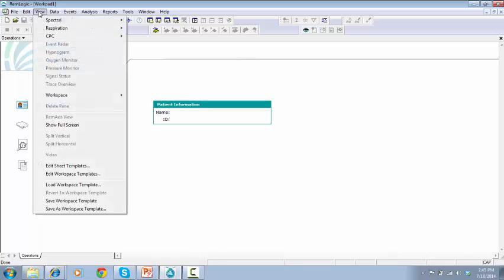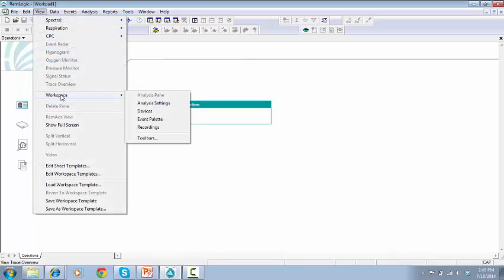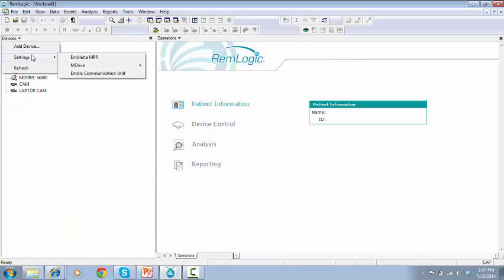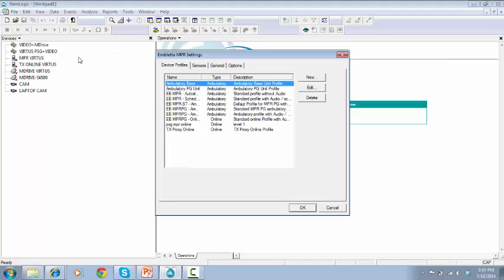Go to View, Workspace, and select Devices. Click on Devices, go to Settings, and choose the device you want to customize. In this case, we'll choose Embletta MPR.